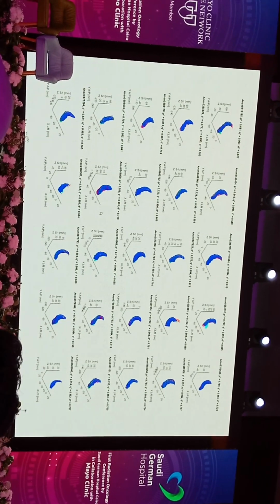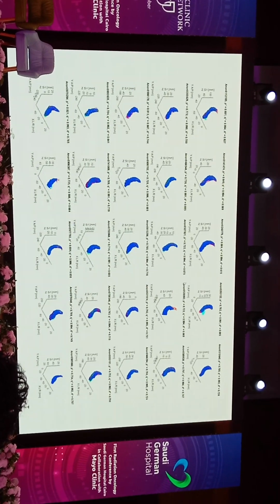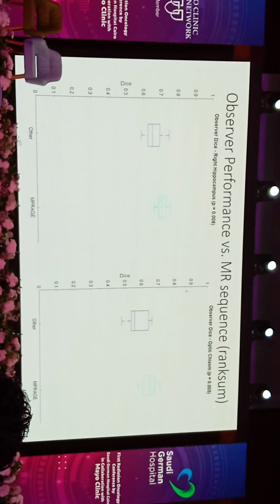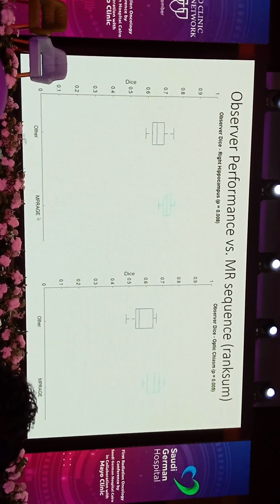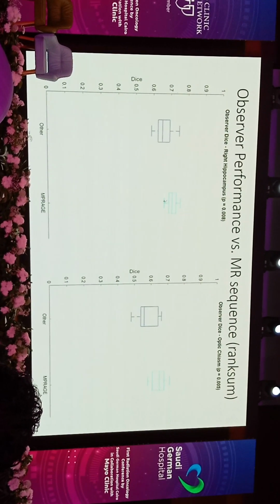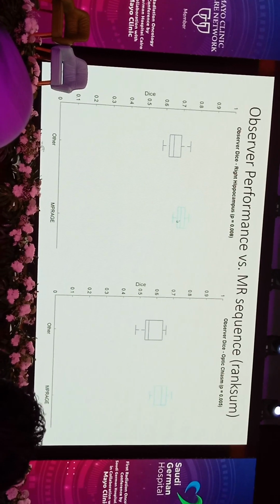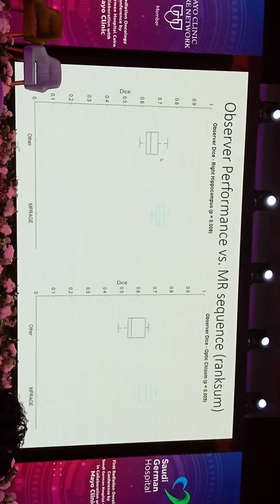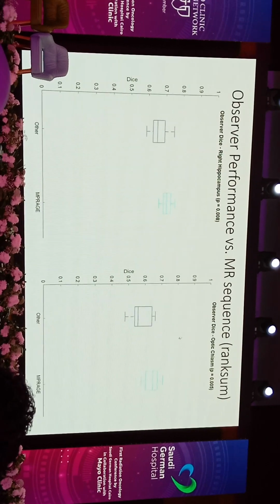If we look overall at a number of different scans in hippocampi that are contoured, as well as optic chiasms, what we see is that the quality of the MRI that's registered makes a huge difference. So for those scans where a high quality MRI was available, there was less variation in the dice coefficient, and the overall median dice compared to the gold standard was higher versus lower quality MRIs. And that was true for the hippocampus as well as the optic chiasm.